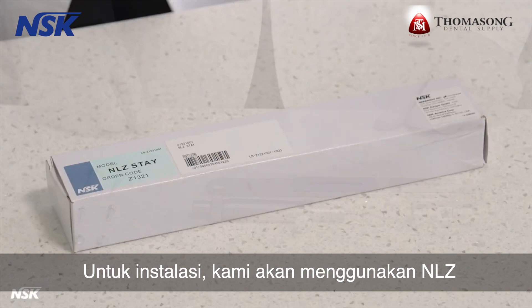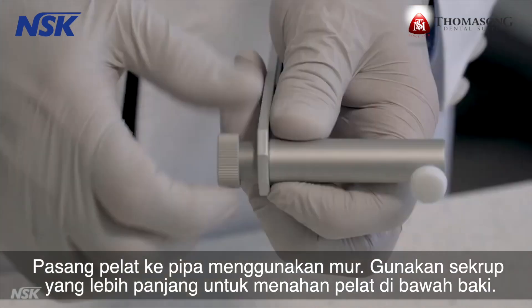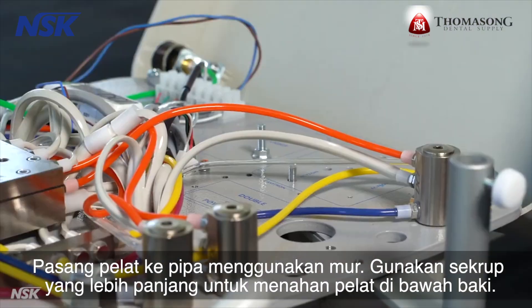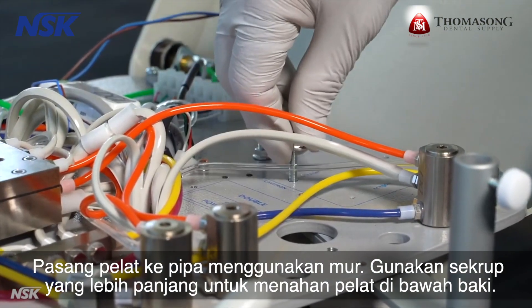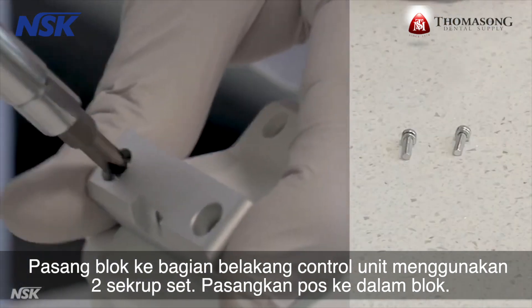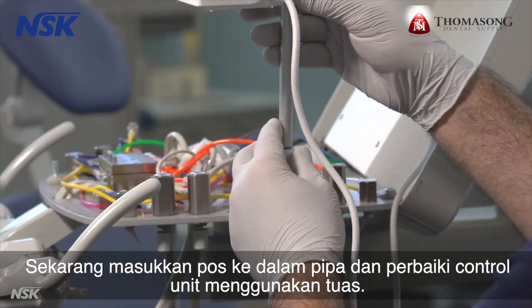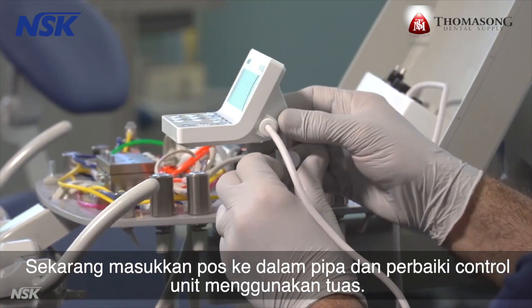For this installation, we'll be using the NLZ Stay. Attach the plate to the pipe using the nut. Use the longer screws to secure the plate under the tray. Attach the block to the back of the touch panel using two set screws. Screw in the post into the block, then insert the post in the pipe and fix the touch panel using the lever.